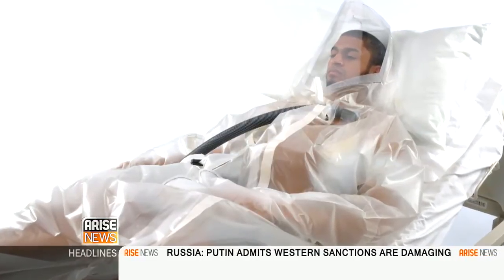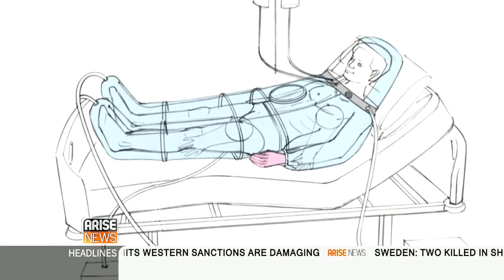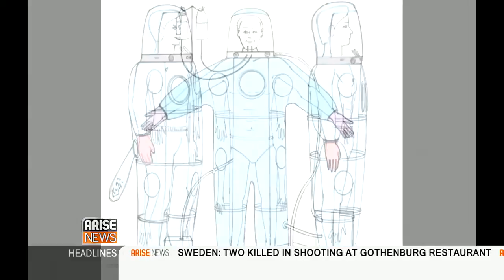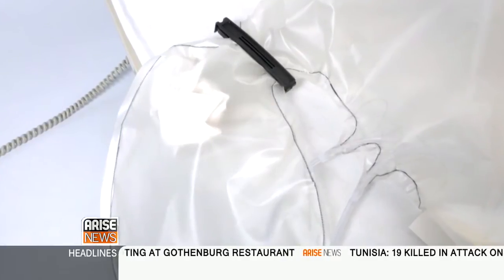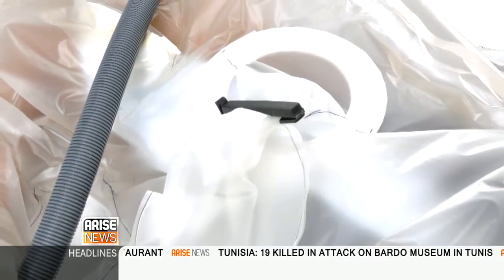How do you compensate for that? Well, quite. These are very good questions. And actually, the purpose of prototyping and this type of design work is to raise those questions, look at them collaboratively with the experts, and come up with solutions. So in posing those questions, we might say, well, we can air condition the suit. The suit can have its own environmental control, which can be done quite cheaply. In terms of caring for the patient and cleaning them, there's work being done on that at the moment. There are current methods of cleaning and looking after patients which will apply in this suit.